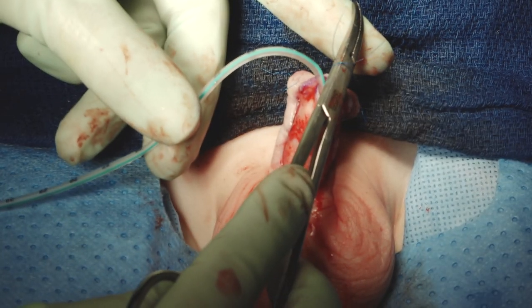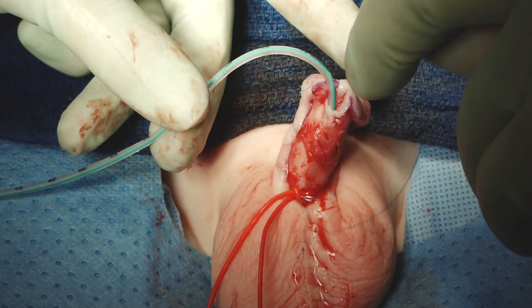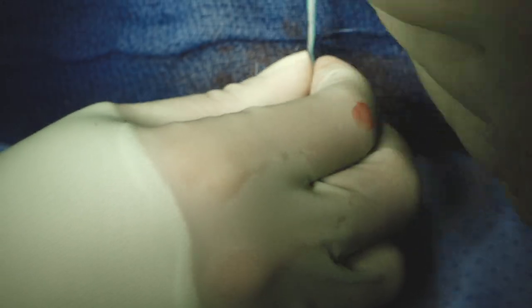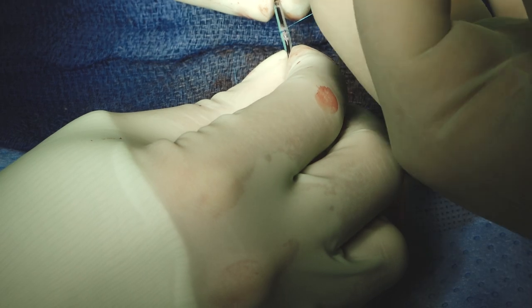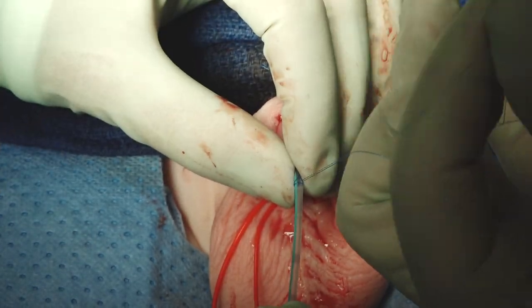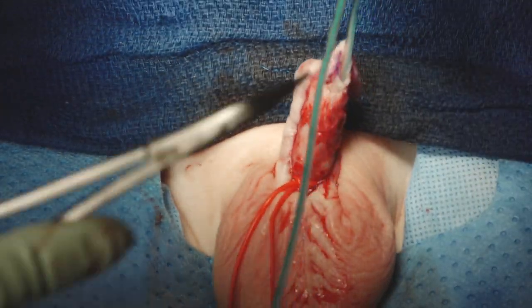Our previous viewers will also note that we have a different catheter in place. We loved the Kendall, AKA Dover catheter — a six-French silastic catheter — but they have stopped making it. Now we use six-French feeding tubes, and for a small glans of 13 millimeters or less, we actually use a five-French feeding tube because we don't want any tension on our glans closure. We measured this boy at the beginning of the case — he was a 15-millimeter glans width.